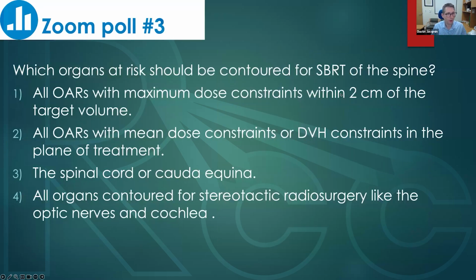All right, poll question 3. Which organs at risk should be contoured for SBRT of the spine? Start my handy dandy timer, and here we go.